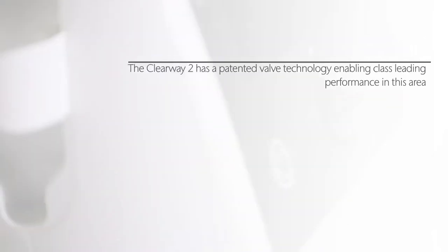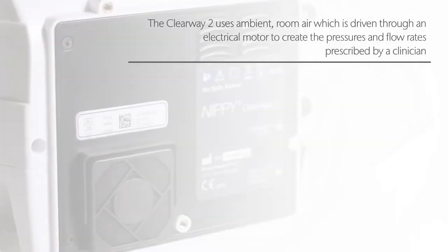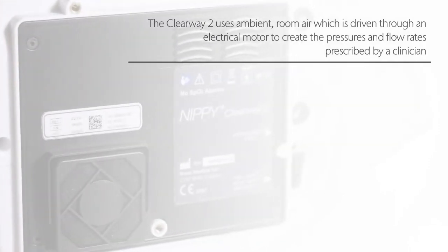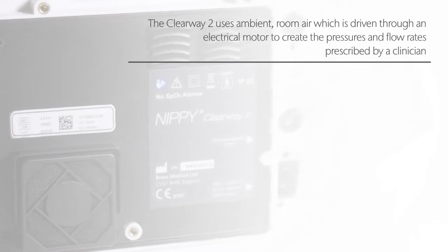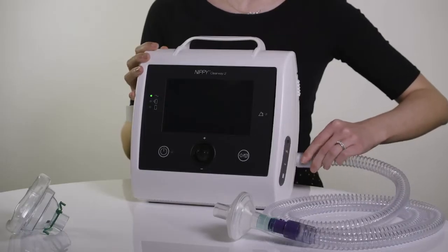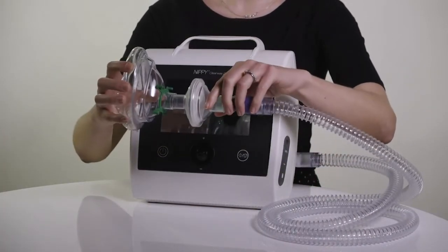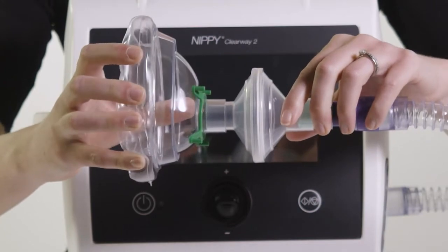The Clearway 2 uses ambient room air which is driven through an electrical motor to create the pressures and flow rates prescribed by a clinician. The air is delivered to a patient by a connecting tube or hose known as a circuit. This is then connected to an interface such as a mask which then delivers the air to the patient.